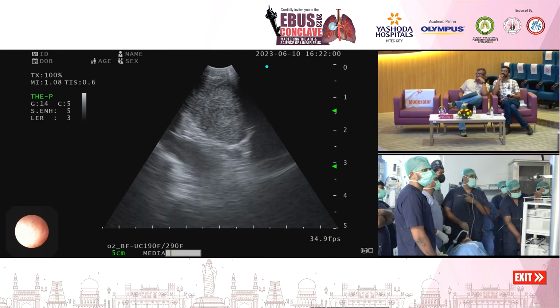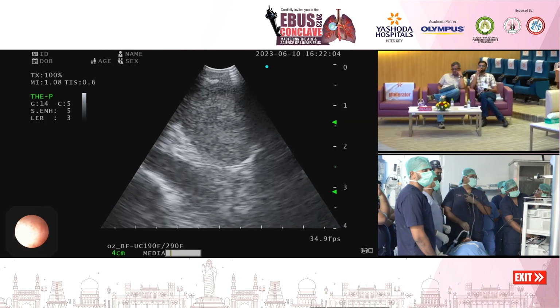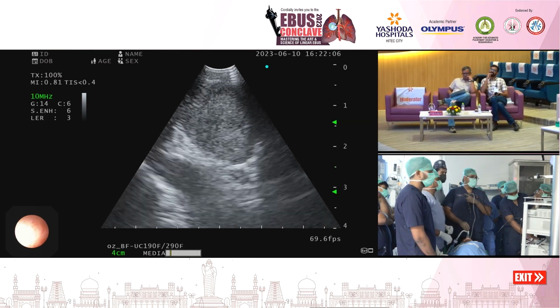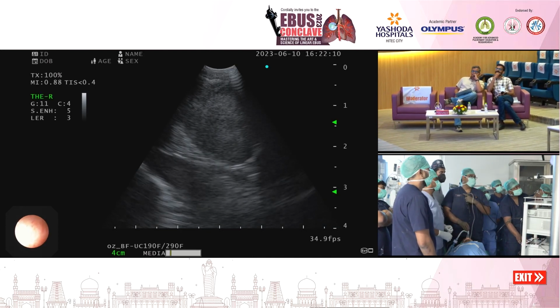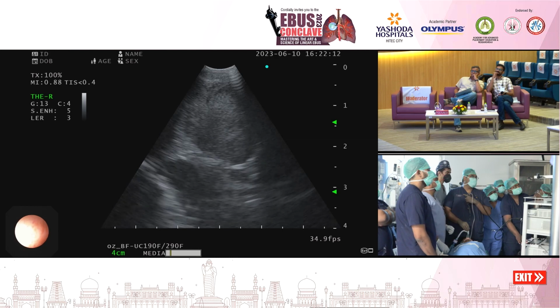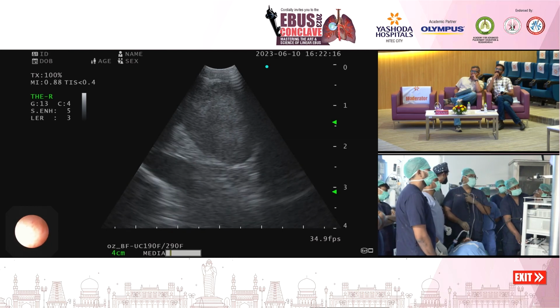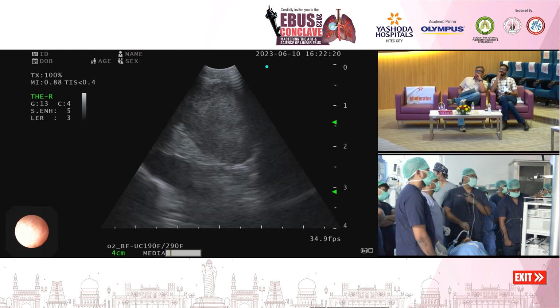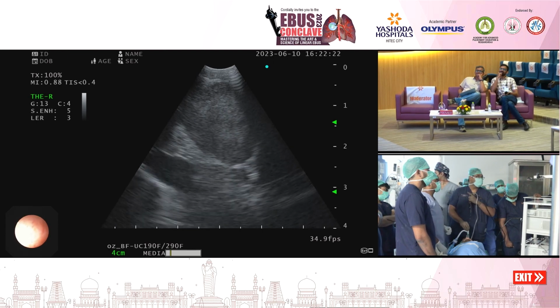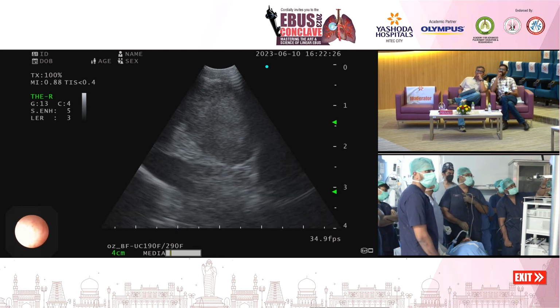Okay. Now this is back to the B mode. Now we will use THER. So THER, R stands for resolution. So basically this is used for a small node. In case you have a small ill-defined node, on using THER mode, the node will become more clear and more well defined. And on the top you can see there are green letters. Now what mode is there? B, THEP and THER. Quickly we will do the elastography also.